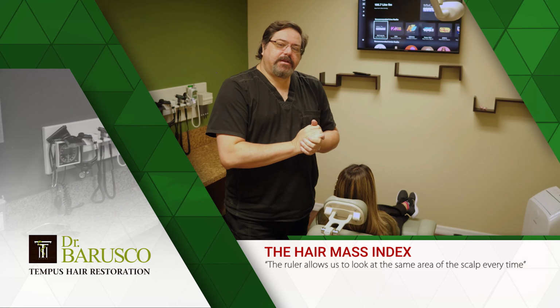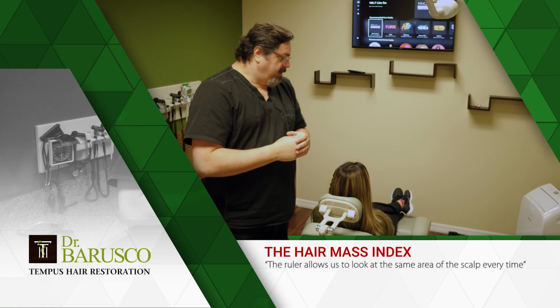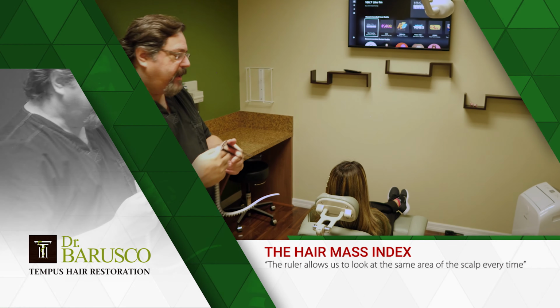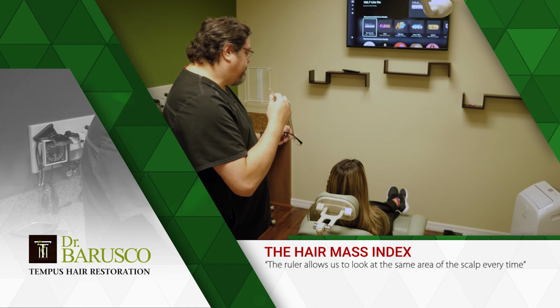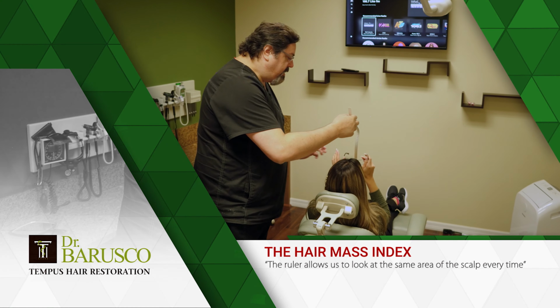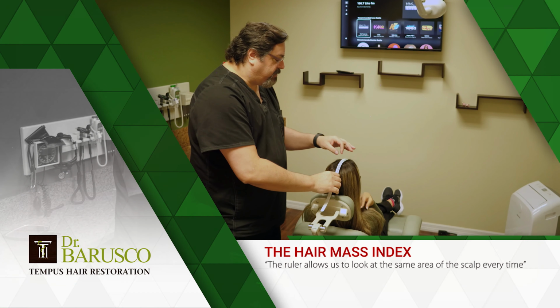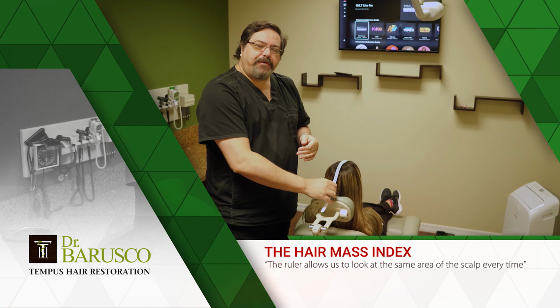So I'm going to walk you through how we do the hair mass index measurement. So we have our volunteer here. I'm going to ask her to take her glasses off. So we give the patients these little eyeglasses here. And it has, as you can see, this measuring device. That's done so that we can measure the same hair every time the patient comes back for follow-ups.